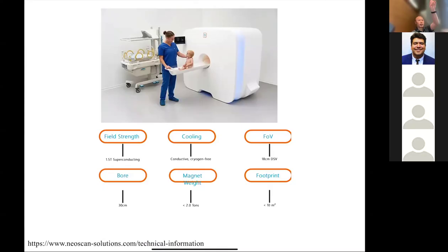Because the other way you can die in an MRI room is if, let's say we're in this room and for whatever reason, it started quenching, so it started giving off helium. Okay. So this room will start filling up with helium, right? So in that case, what should you do? How should you get out of this room before you die? So you have this thing that's giving off helium.